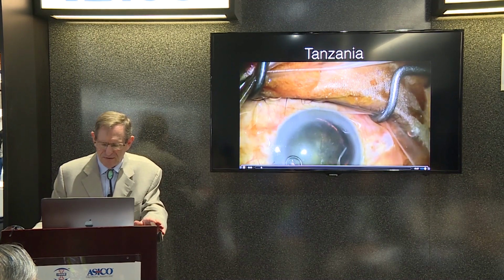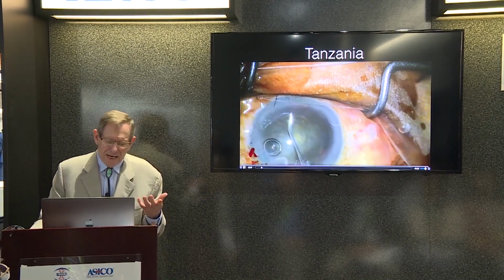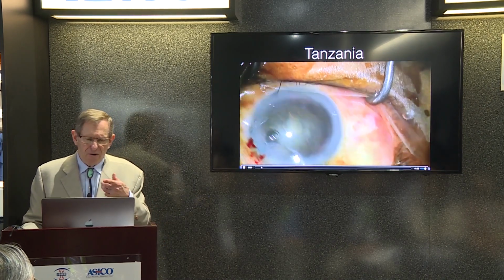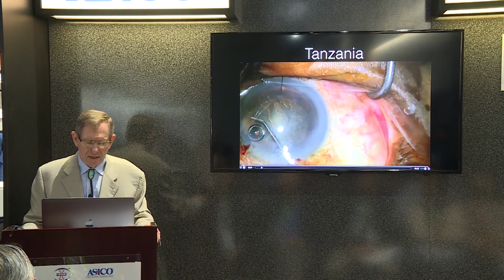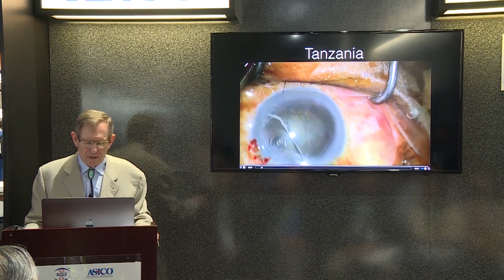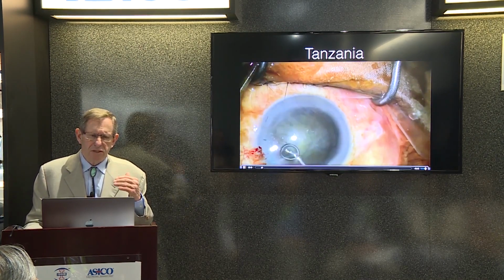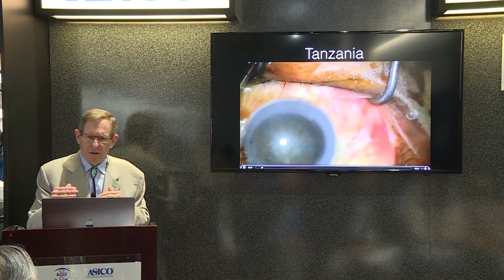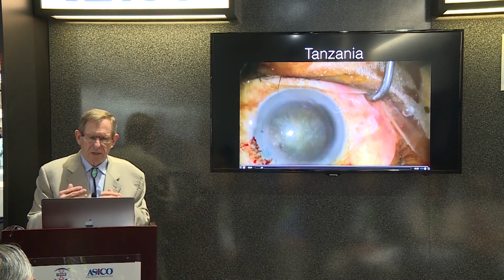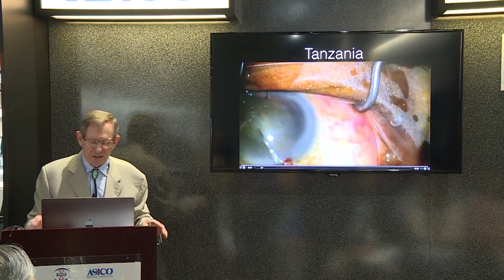So here's the use of the Akahoshi. This is a relatively hard cataract, so you can't see very well to the back. And I know from our course on Saturday that Taka's going to show you some rocks that he's able to get with this instrument. But I've been going there for about 10 years, and the difference this year is that we're transferring Phaco techniques to the local ophthalmologist for cost recovery.